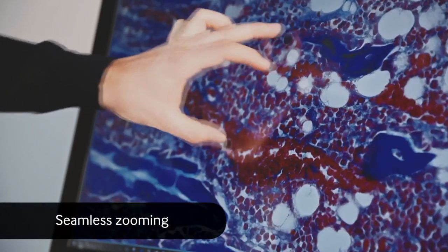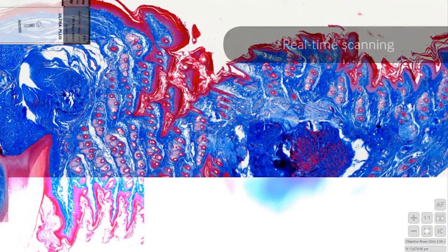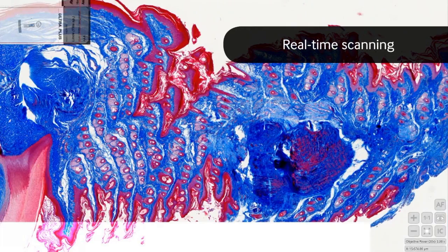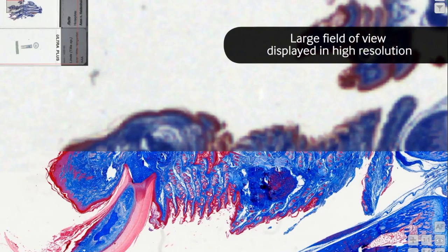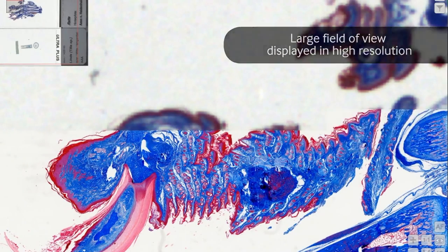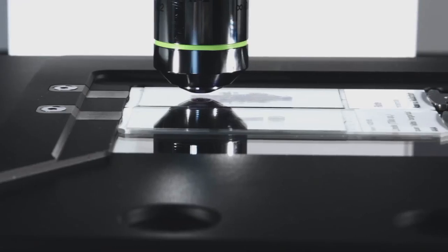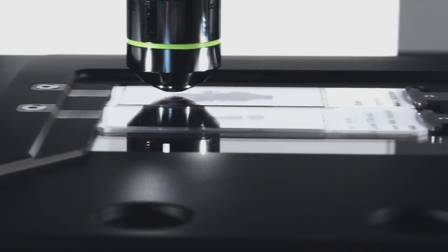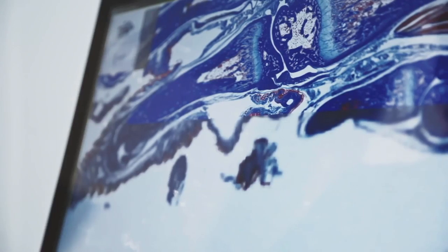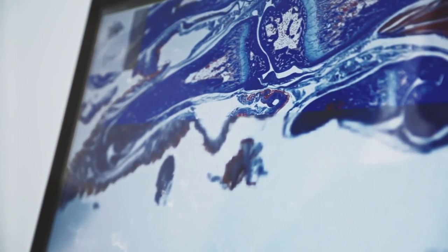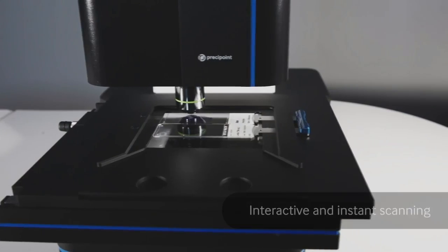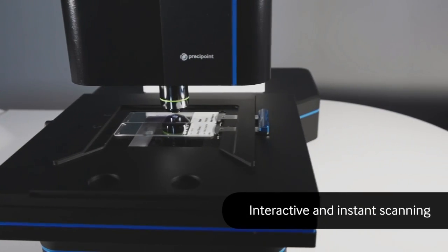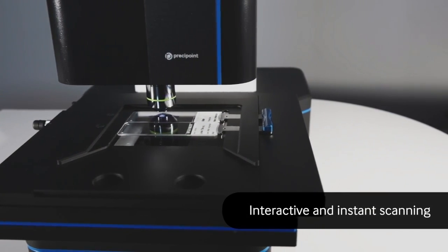As you navigate through the slide, the sample is scanned in real-time, resulting in a large field of view consisting of many combined high-resolution images. Never seen before in microscopy, this is what we call interactive and instant scanning.